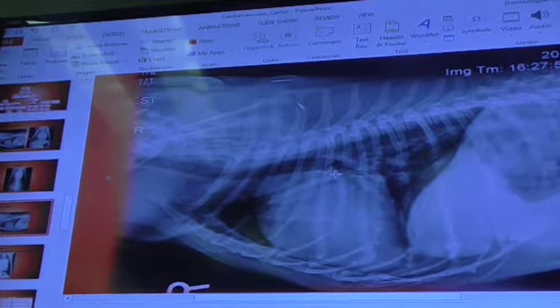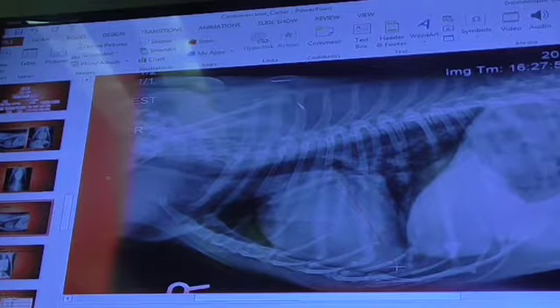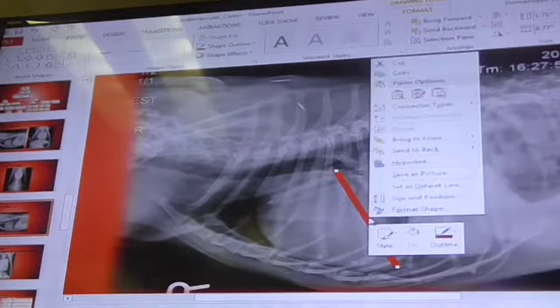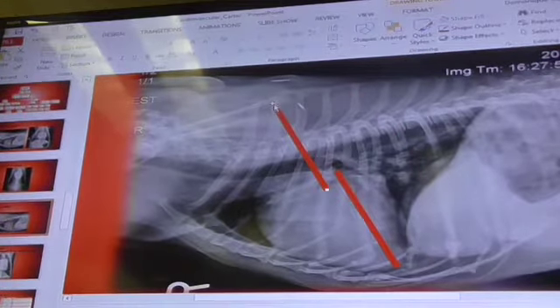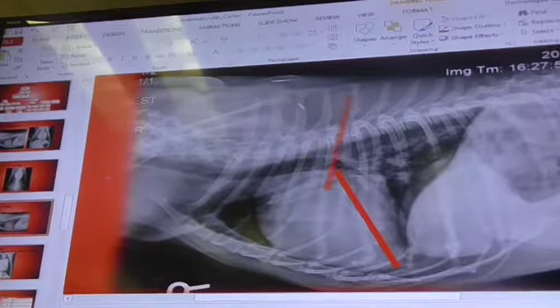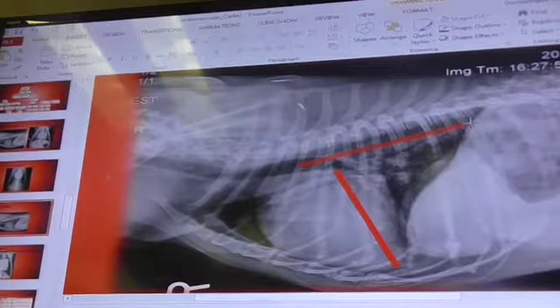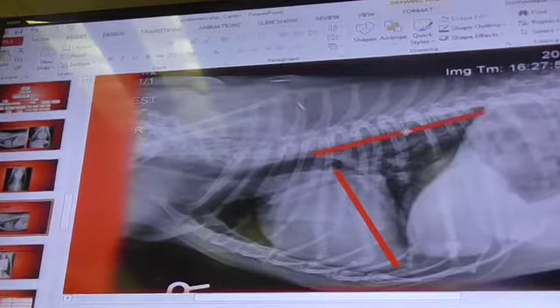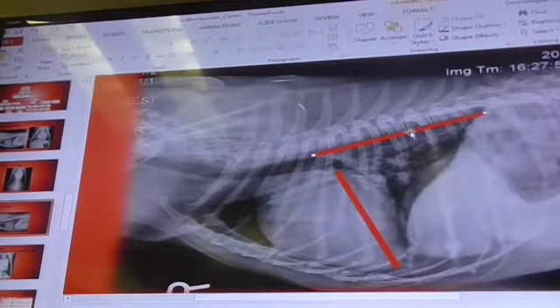All right. So, long axis. Started from the carina and went down to the apex. About right there. Okay. Let's make that a little thicker. And then I'm going to copy that, paste that, and rotate that. It's not going to work. Click on it, it's going to shorten it. There should be a rotate button. Go to format, it should tell you the length of it. No, the line was too long.